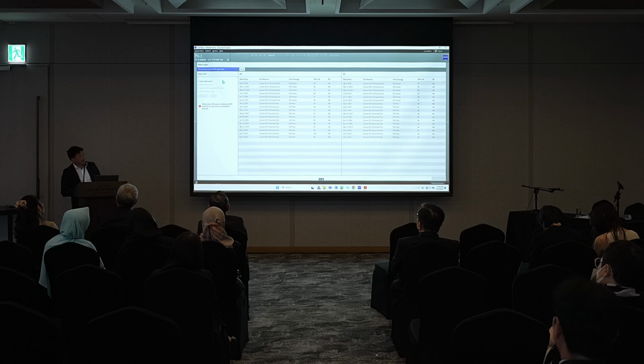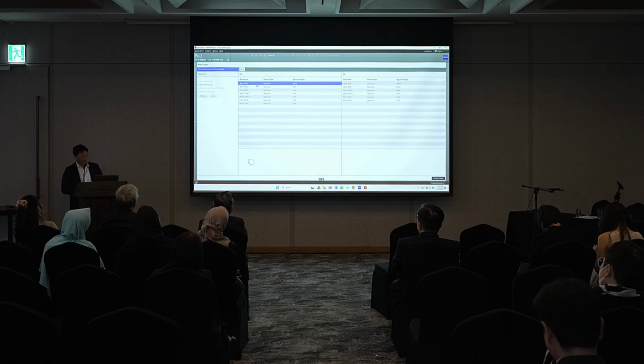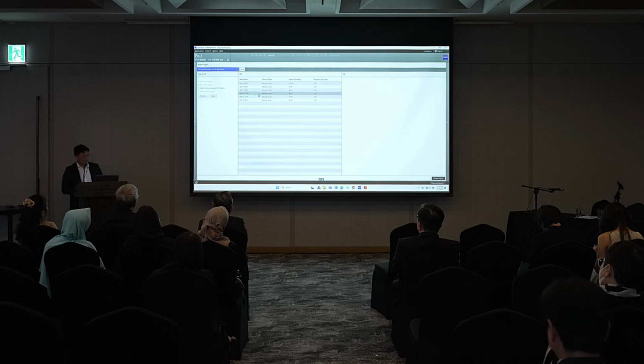It's all spelled out for you. I mean, if you can read, you can use Zeiss Forum. So, step number one, select the Humphrey Visual Field Exam. So let's do this patient's right eye. We're going to select his last field, and let's click on Next. Now it's going to ask us to select the OCT exam that you'd like to display. And so once again, we're going to choose one from the same date and click Next.